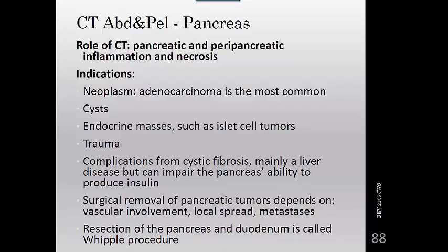So, multiphasic protocols are common for pancreatic indications. Most commonly, data acquisition is timed to coincide with the late arterial phase of pancreas, which is about 35 to 40 seconds after the injection, and then portal venous phase also about 60 to 70 seconds after injection. Because the exact timing of these phases is patient dependent, a lot of times you need to use the bolus tracking software.